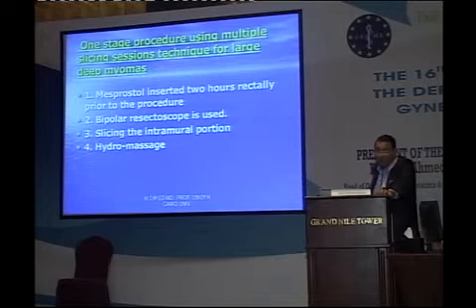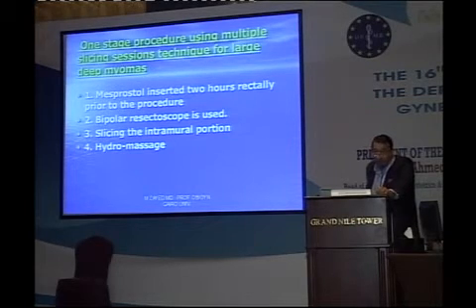So actually, what I'm presenting today is a one-stage procedure using the multiple slicing sessions technique for larger deep myomas. The technique involves misoprostol that is inserted rectally 2 hours prior to the procedure. This will enhance uterine contractions and also help you to have a better cervical dilatation.